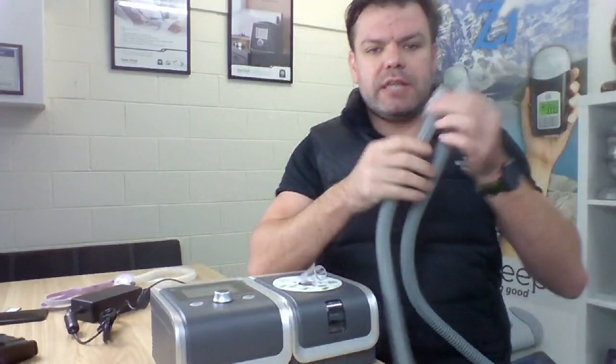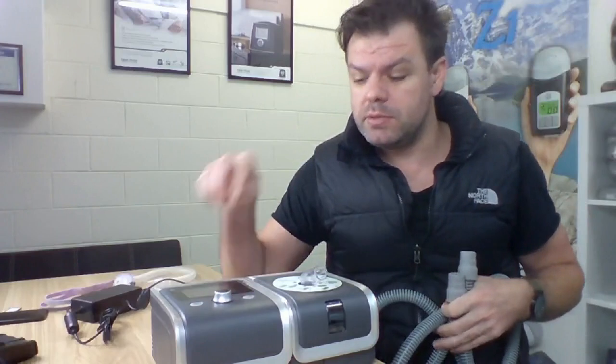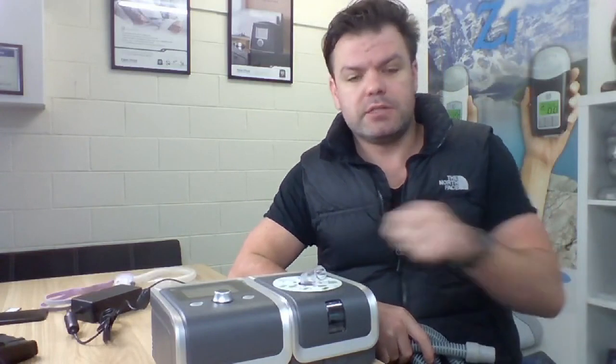What that means is it doesn't have a copper coil that runs through the tubing like some of the other fancy machines have. Some of the high-end ones have what we call a heated tube system. This is just a standard tube system, which is fine. People have been using standard tube systems forever. If you want to, you can get what's called a HumidAire heated tube system for this machine. They're between about 130 and 150 Australian dollars, and that is an external heated tube, so it works the same way. It's got a copper coil that runs through it. You plug it into just a wall socket at home, and that has its own little power supply.